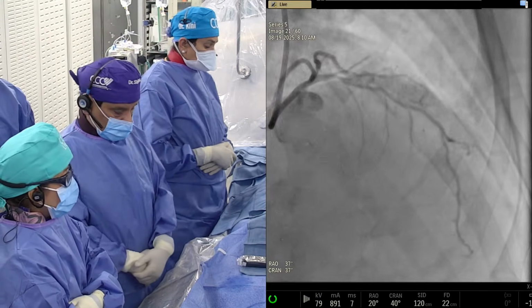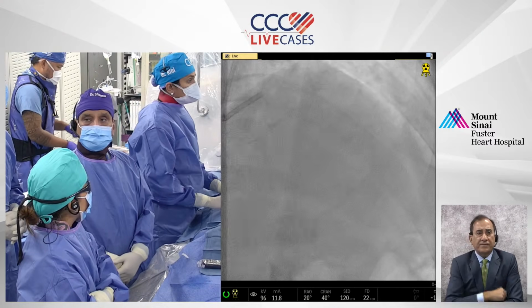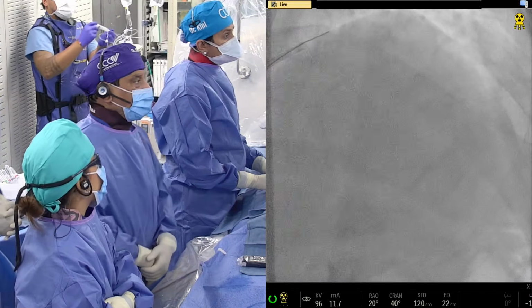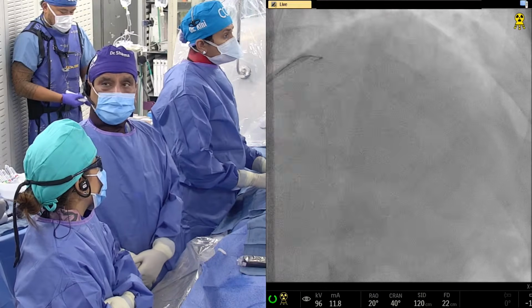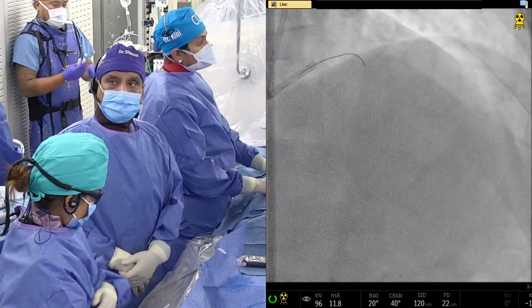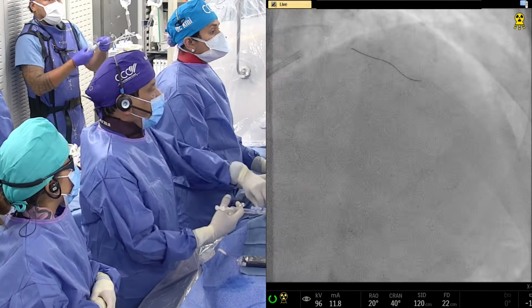the future. So there's another question from Dr. Mahmood Al-Rais regarding the use of FFR guidance here. Yeah. So this patient has, as we saw, a very positive stress test. Now, a lot of people actually, after the DCB, are doing the FFR and iFR just to see that the flow has become good and there is no dissection. Some people even do the imaging to see that there is not a significant dissection, and then go to the strategy of DCB. So those things will be incorporated.